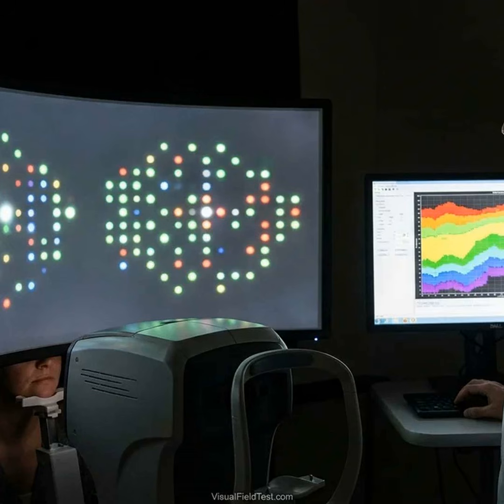For example, blue-on-yellow perimetry, short-wavelength automated perimetry, SWAP, presents a bright blue target on a yellow background to isolate the short-wavelength, blue cone pathway and its small bistratified RGCs. Similarly, red-green chromatic tests aim at the long- and medium-wavelength cone pathways, the parvocellular system, and flicker temporal tests, like frequency-doubling perimetry or high-frequency flicker, stress the large parasol, magnocellular RGCs. By dissecting vision in this way, clinicians hope to catch damage in specific RGC subtypes earlier or more precisely than with white-on-white testing.